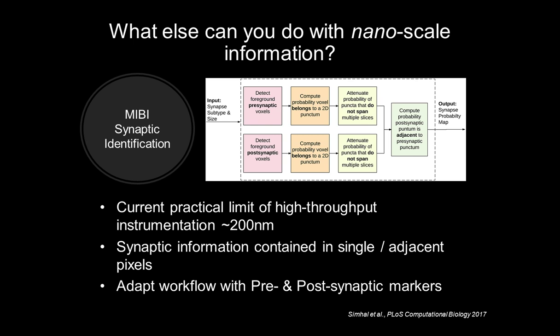For instance, vascular and blood-brain features, or in this case, synaptic features. While assessing overall synaptic density is important, it's also probably interesting to extract synapses the same way we would extract cells and treat them like populations, understand their composition and localization, because that might have some information in there too.